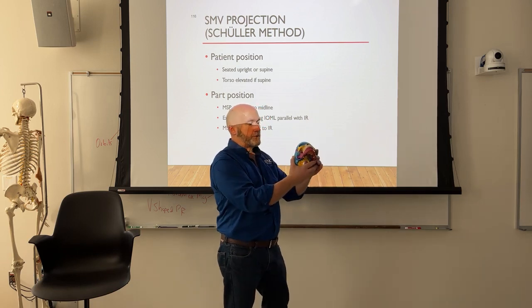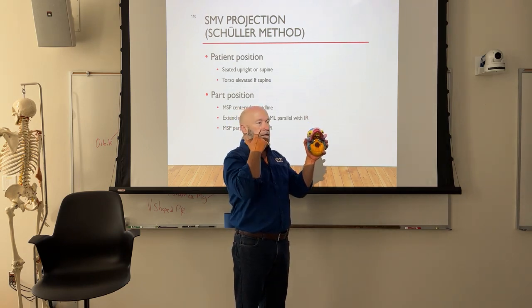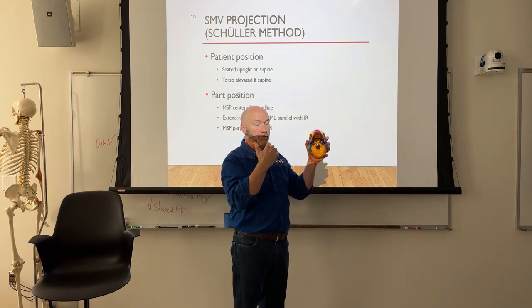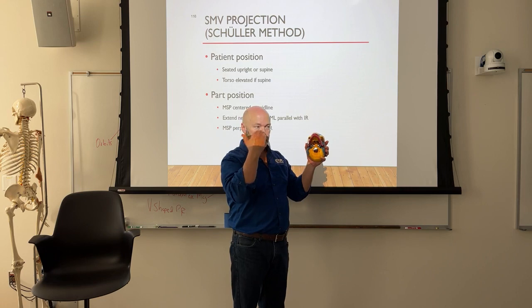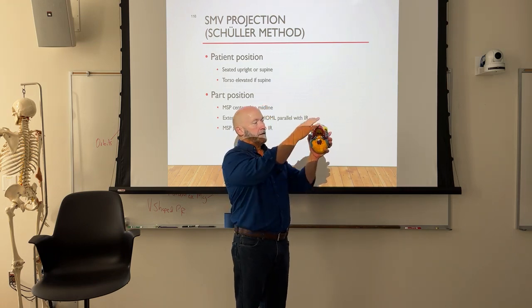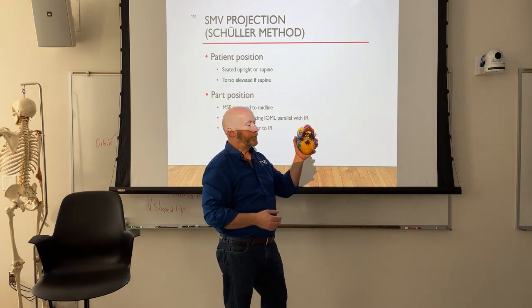So on positioning, extend the patient's chin back far enough, and you'll start to see the nose sticking out, right? And then you'll just start to see the cheekbones. Once you get to those cheekbones, you're pretty much there. You'll see the soft tissue of the cheekbones puffing up on either side of the nose, and you're pretty close to where you need to be at that point.